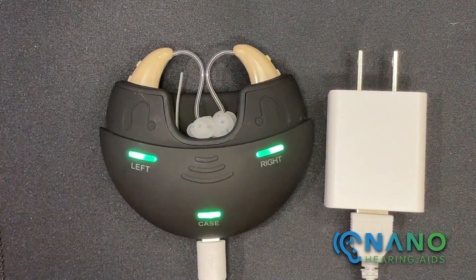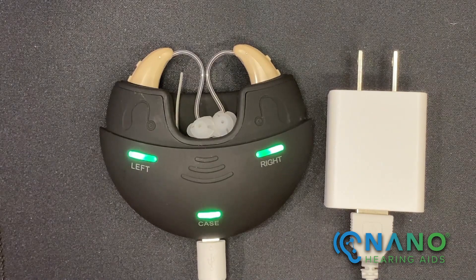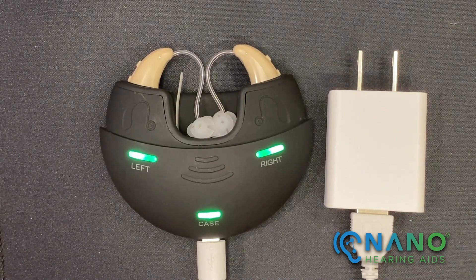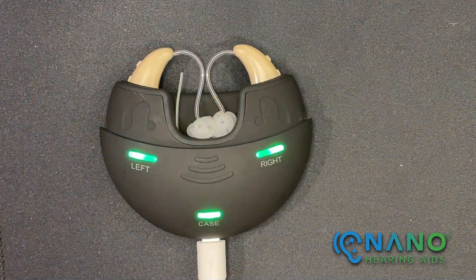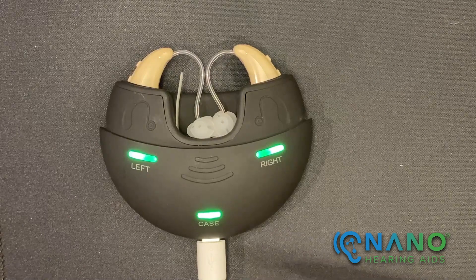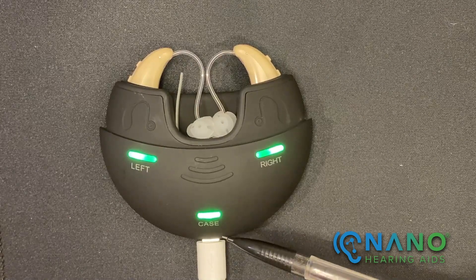To charge the charging case, plug the larger end of the charging cable into the charger plug. This can be plugged into the wall. Connect the smaller end of the charging cable into the bottom of the charging case.